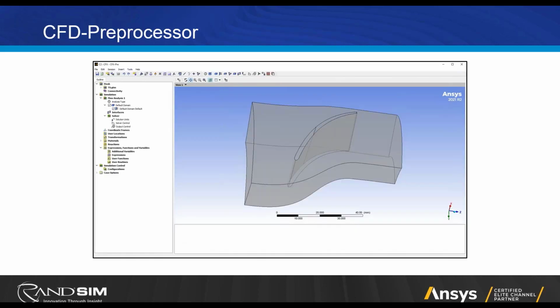Next slide. Okay. So after you get the mesh, the next step is to apply boundary conditions. We have to do that before we run the simulation. And this is the CFX-Pre GUI, it's called, which is where we apply those boundary conditions. In this case, you're going to have an inlet on the left side here, an outlet on the right. And then we're only modeling one blade, as you can see.